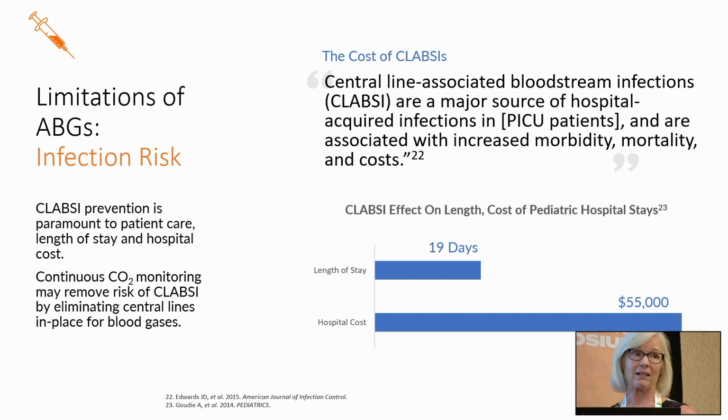The other problem with blood gases, of course, when you're drawing blood, there is going to be the risk of infection, whether you're doing an arterial stick or a capillary stick on a patient or even a venous stick. That risk of infection is there. Pain is always there. Even if a patient has a central line, if you're lucky enough to have a central line, the risk of infection is very high. Central line associated bloodstream infections are the major source of hospital-acquired infection in the pediatric ICU and in neonatal ICUs. And they are associated with a significantly longer length of stay, and they do increase morbidity and mortality, and of course, cost of stay. We always have to throw cost of stay in there in case we've got any C-suite sneaking in here listening to us.